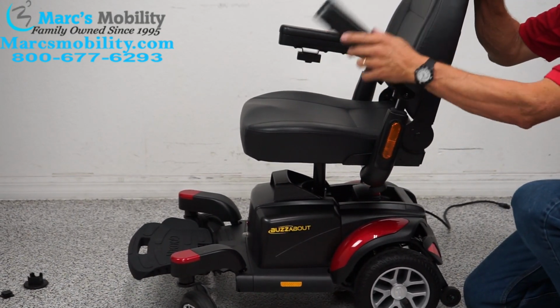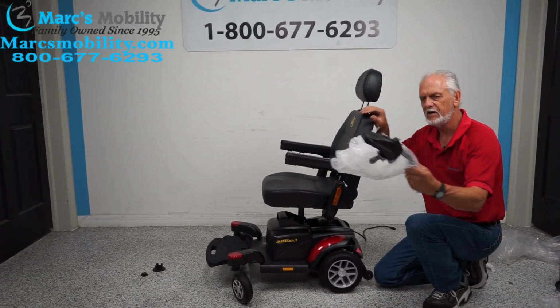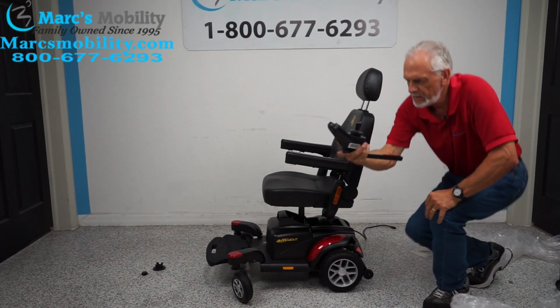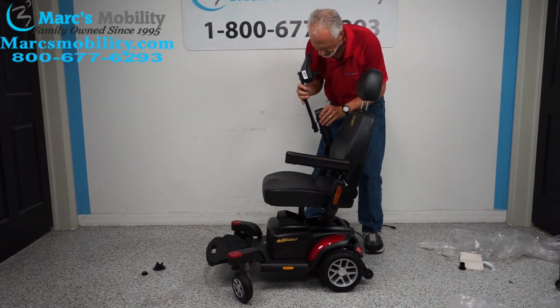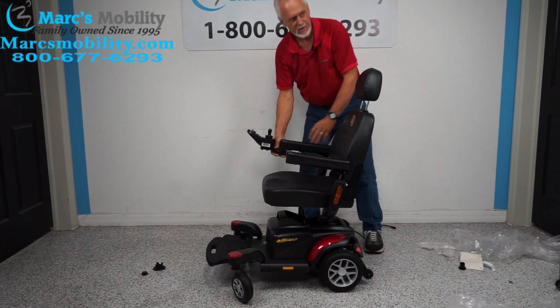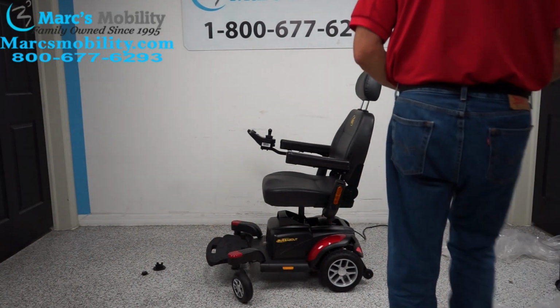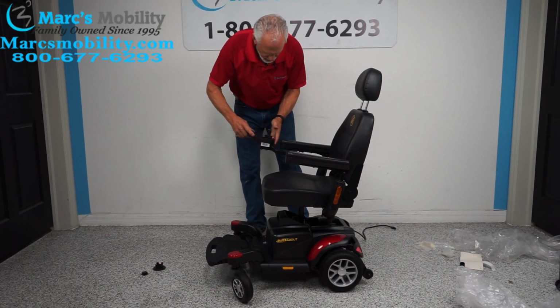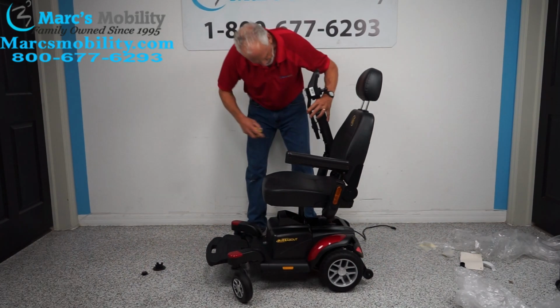Okay, and the arms do flip up. Then you're going to take your joystick, unwrap it, take it out. You're going to slide your joystick right under the arm right here, okay? And you're going to use an Allen wrench set. So you're going to adjust the joystick to the length that you want, here or here. We're going to put it halfway down so it's neutral. And you just hold it there.